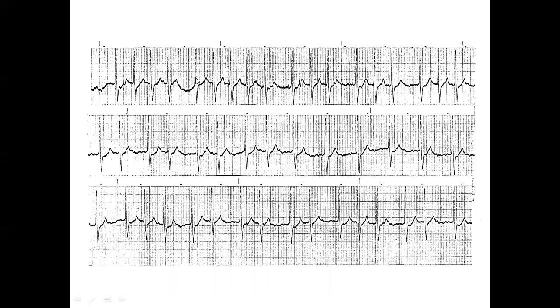Then this is what's happening. Several beats grouped together. And the first one is always longer than the others, and then you cannot put two of these in here. Remember, those are the secondary characteristics or earmarks of a Wenckebach phenomenon. So this is a junctional tachycardia with what we call exit block. Instead of an entrance block, which is impulse failing to get into the junction, now the impulse has difficulty getting out of the junction and manifests as a Wenckebach phenomenon.